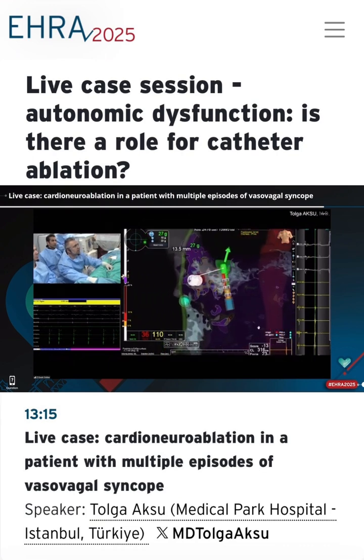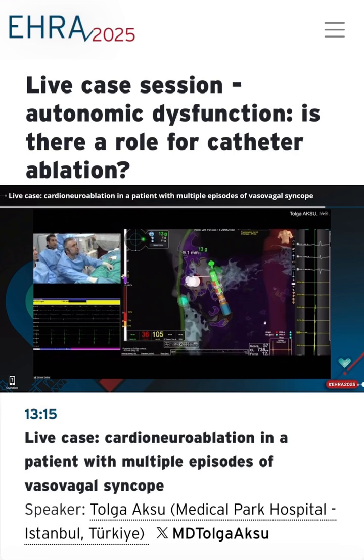And how do you follow up your patients? By symptoms only, Holter ECG, or? Actually, we always try to check Holter recording at 1 month, then 6 months, and then 12 months. Usually for procedural and research aims, because we would like to see the heart rate variability parameters during follow-up as well, and try to find whether there is any difference for reinnervation.